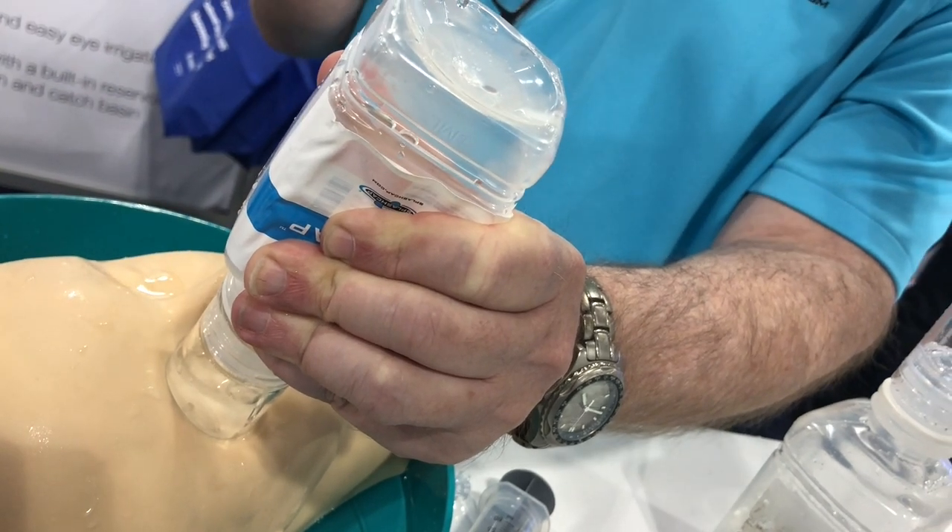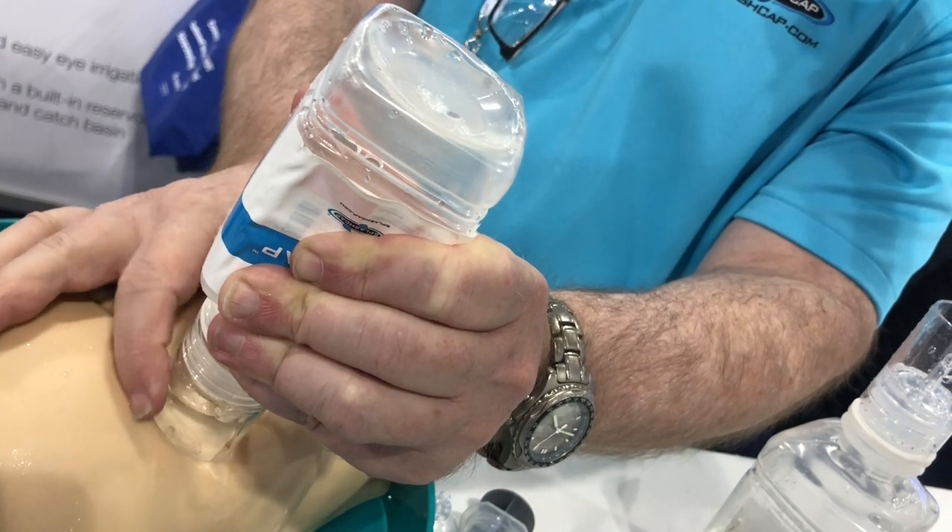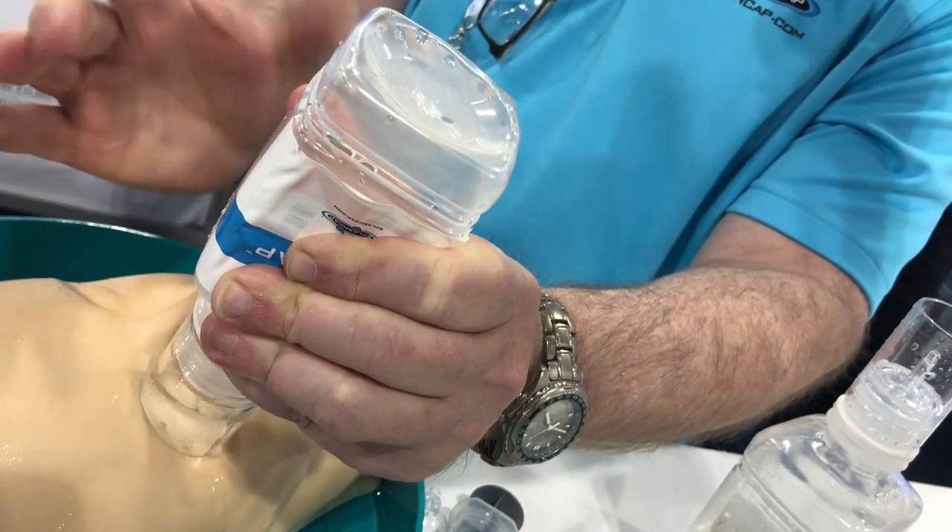Once I have done the decontamination, I'll just keep it on there, and again there's no pressure. I'll pry the eye open, and once they get a little bit of fluid in there, it's kind of game over because they've got a lot of relief going on.